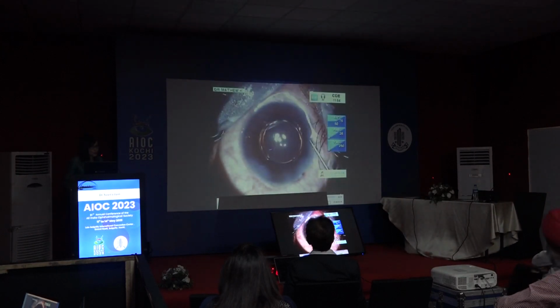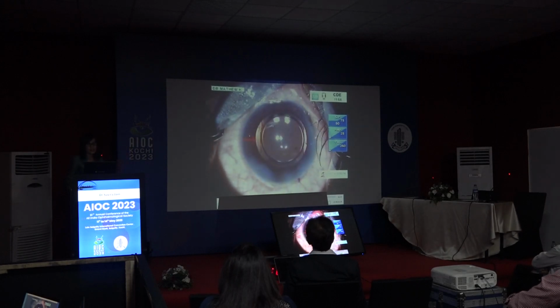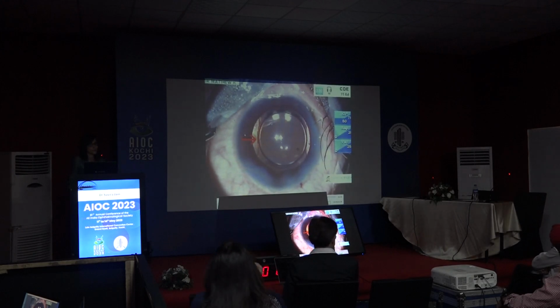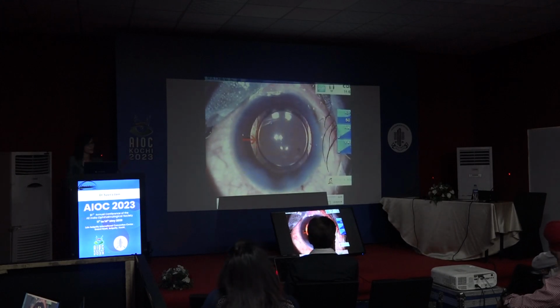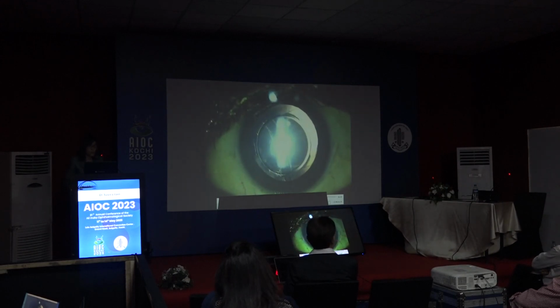And it's not over till it's over. Even stromal hydration itself can sometimes end up with an overpressurized eye, which can result in an opening in the posterior capsule, which happened in this case, which was actually missed and seen the next day. I'll end with my last case.